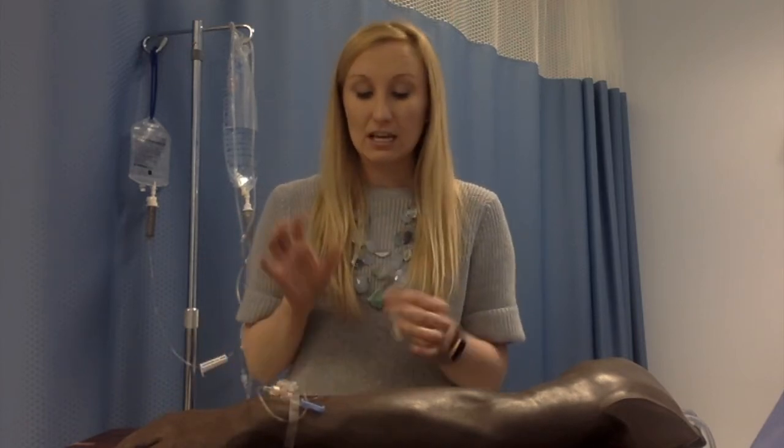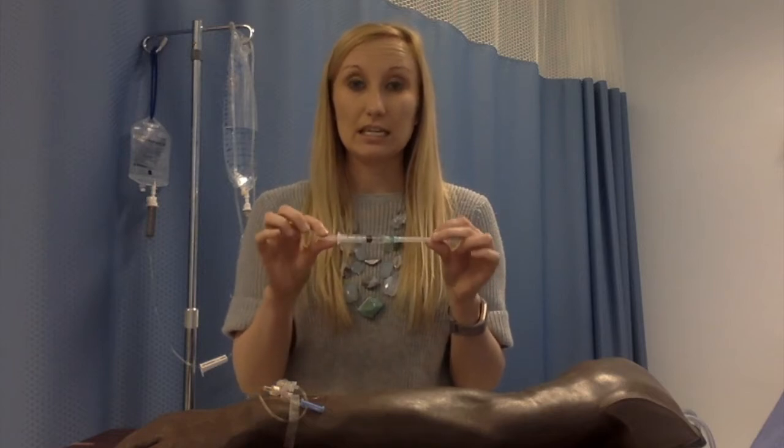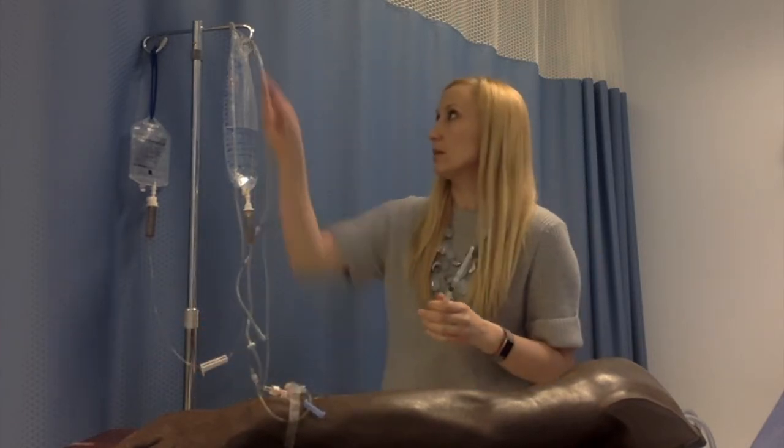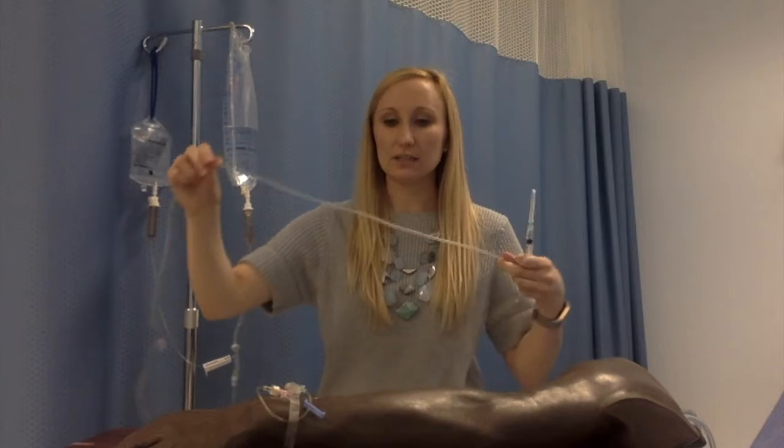This leads into IV push medications. So an IV push medication is any medication that can be given quickly or slowly, however long is ordered, to the patient through either the heparin lock or through the IV tubing. So through a heparin lock, this is where your SASH comes into place: saline, administer the meds, saline, heparin.